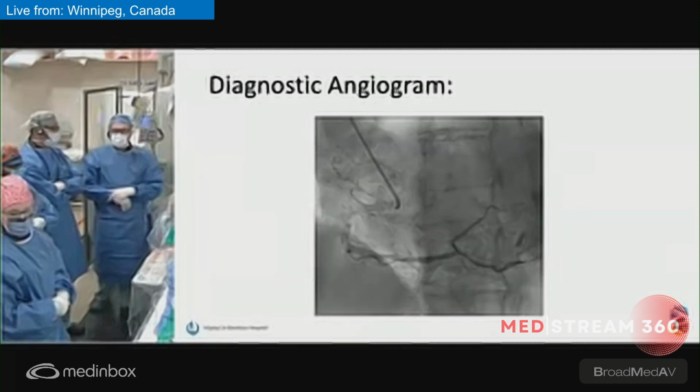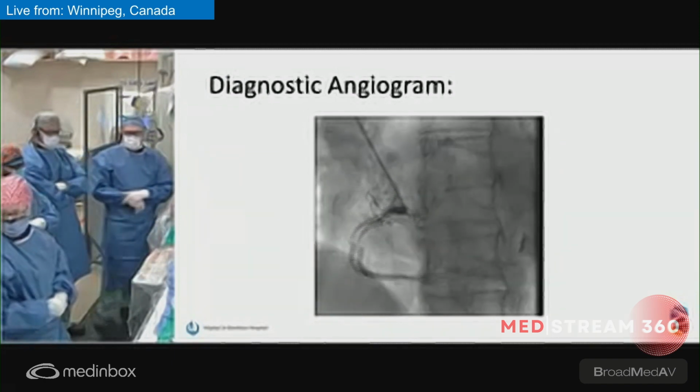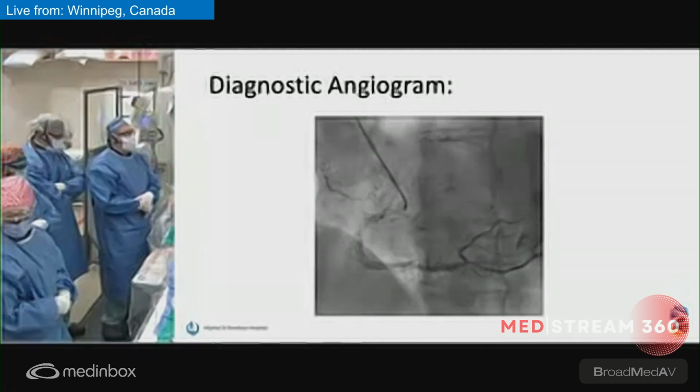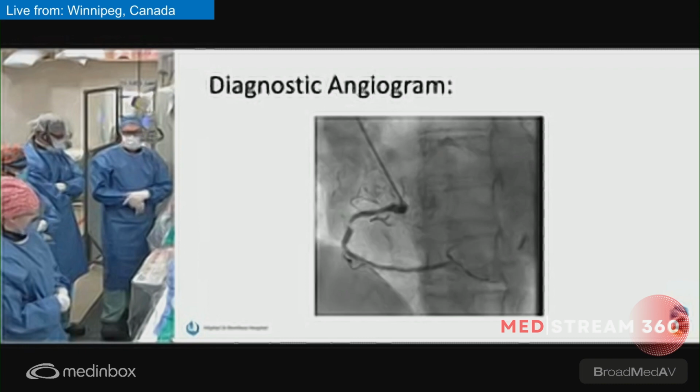You can see also the RCA diffusely calcified. Surprisingly, the stent in the distal RCA is patent, and hopefully we'll leave that for another day. Today, our goal is to be able to recanalize the LAD.